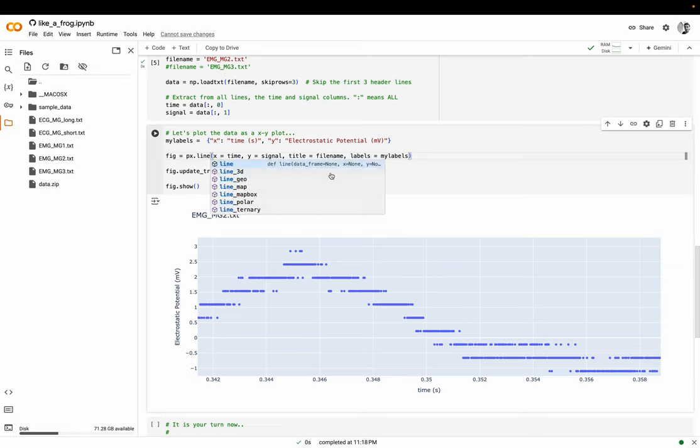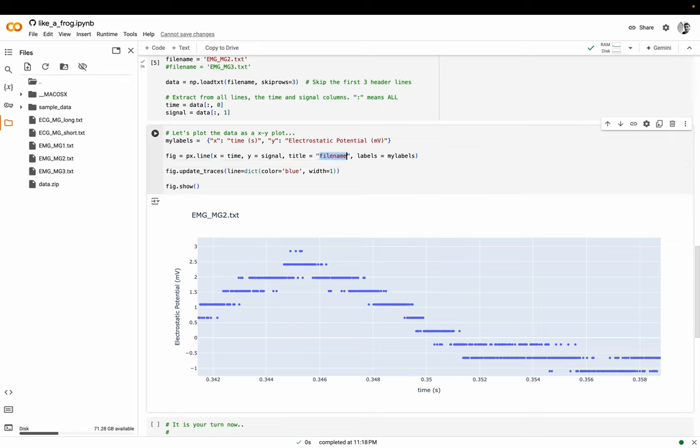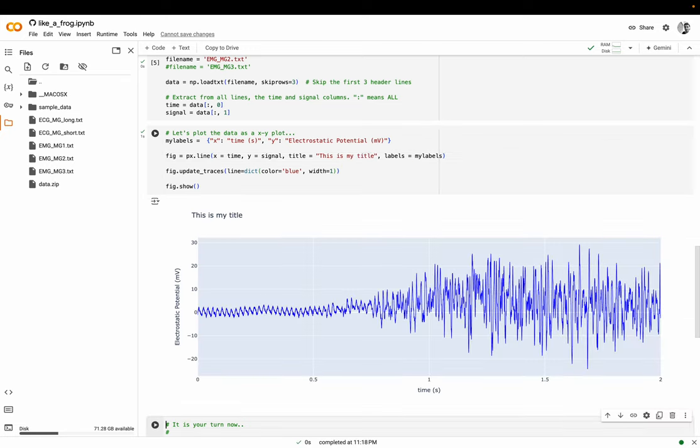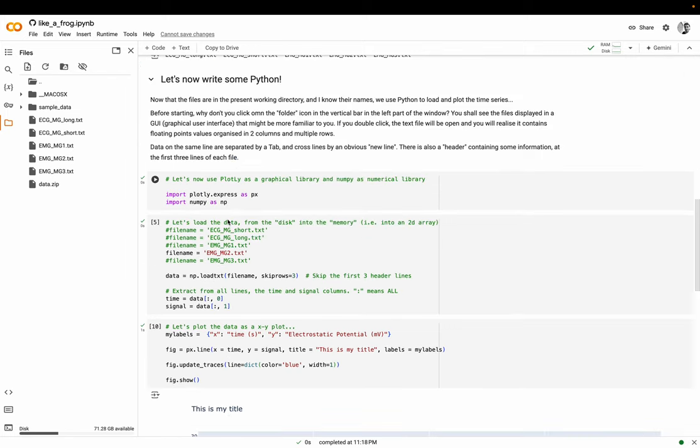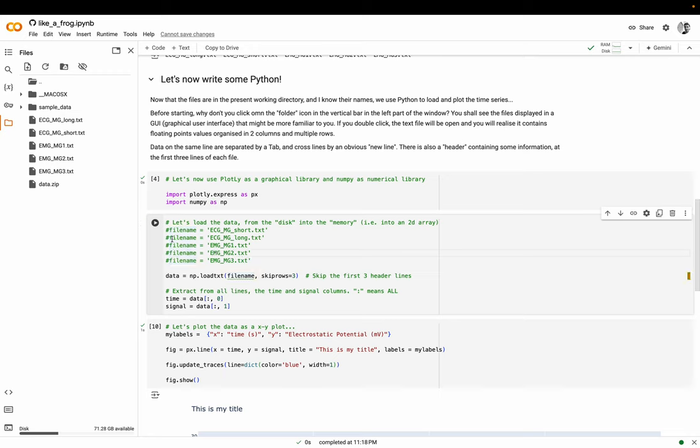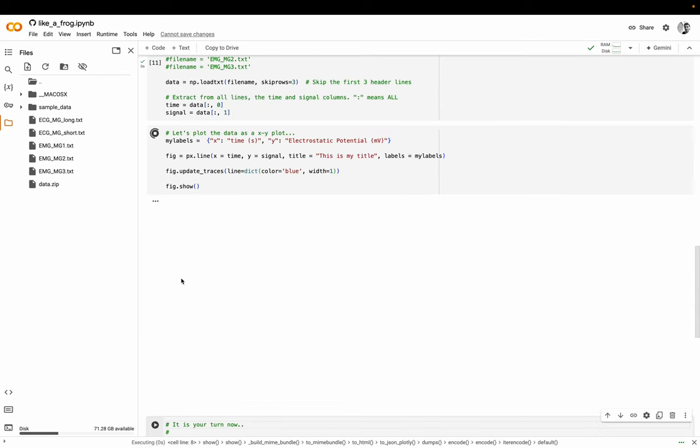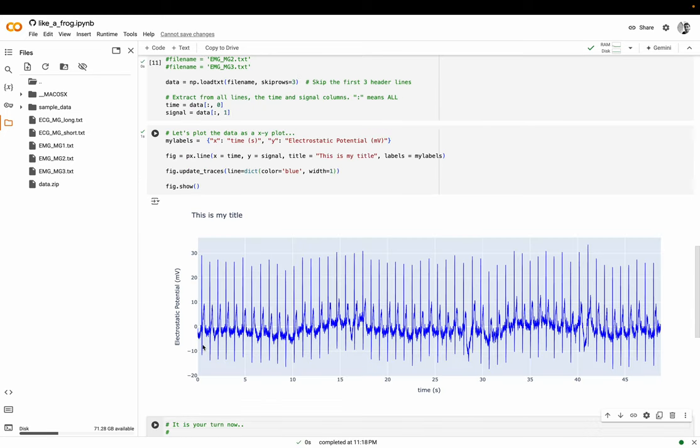Maybe I will change here the title. This is my title and I will run it again. It's not impossible for me to roughly understand what's happening. Maybe I can comment this one and uncomment this. I execute it and I execute the second one so that I have a new plot from the new files.